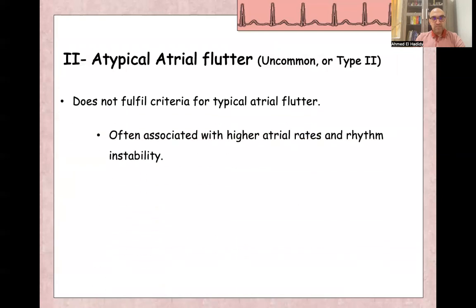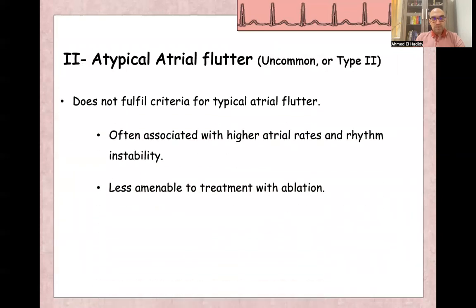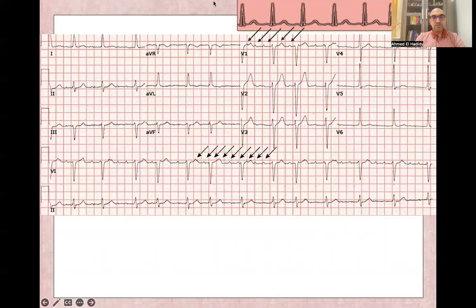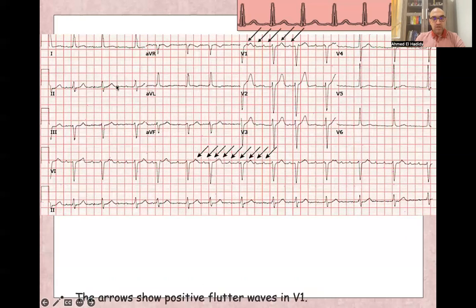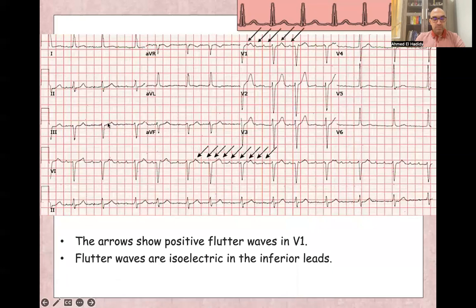Atypical atrial flutter has different criteria, is associated with a higher atrial rate, and is less amenable to catheter ablation. In this ECG example, V1 shows positive flutter waves, while leads 2, 3, and aVF show an almost isoelectric line — distinguishing it from typical flutter.